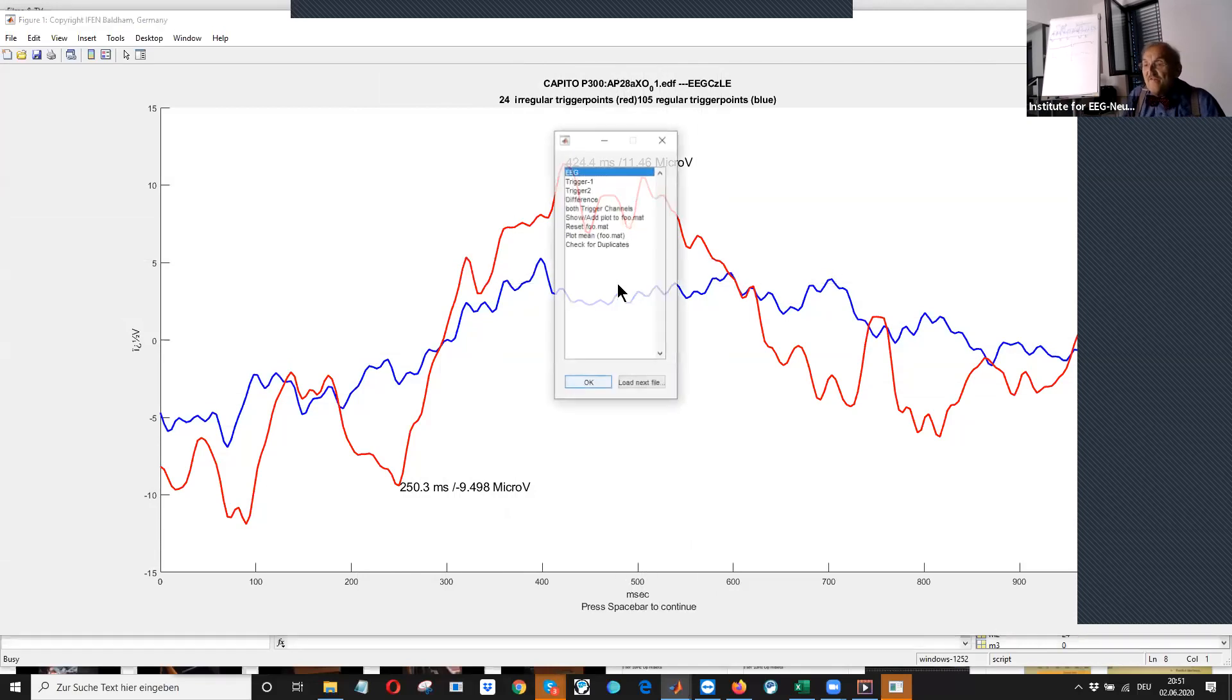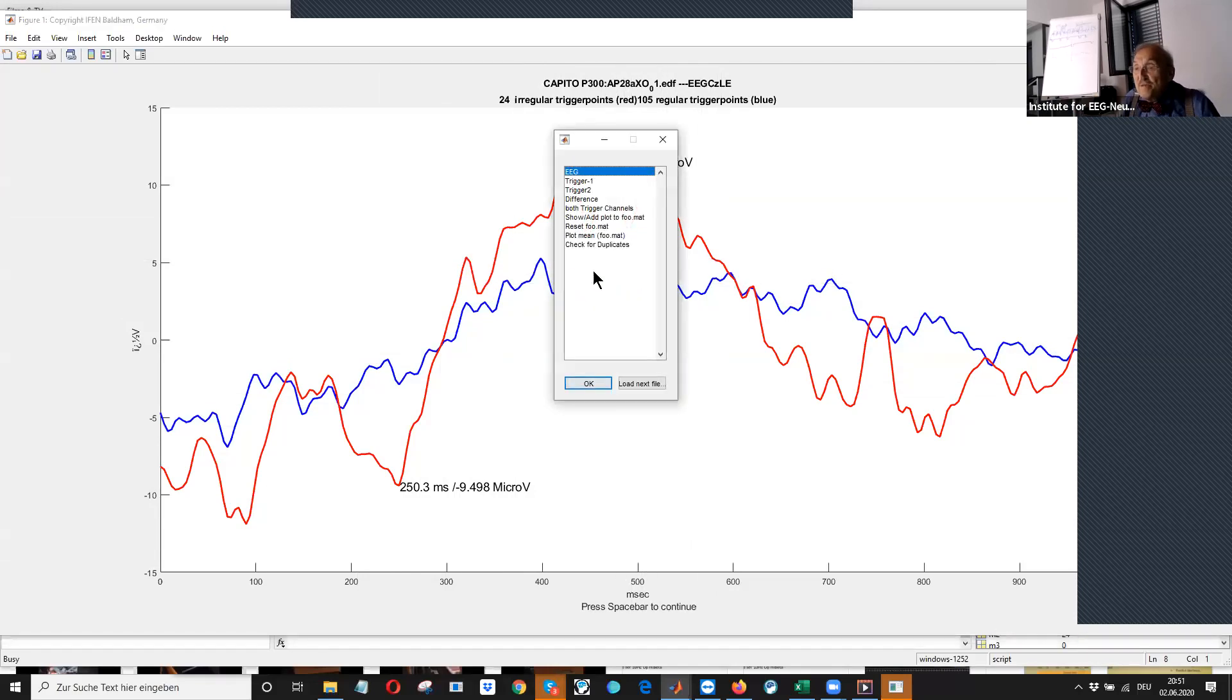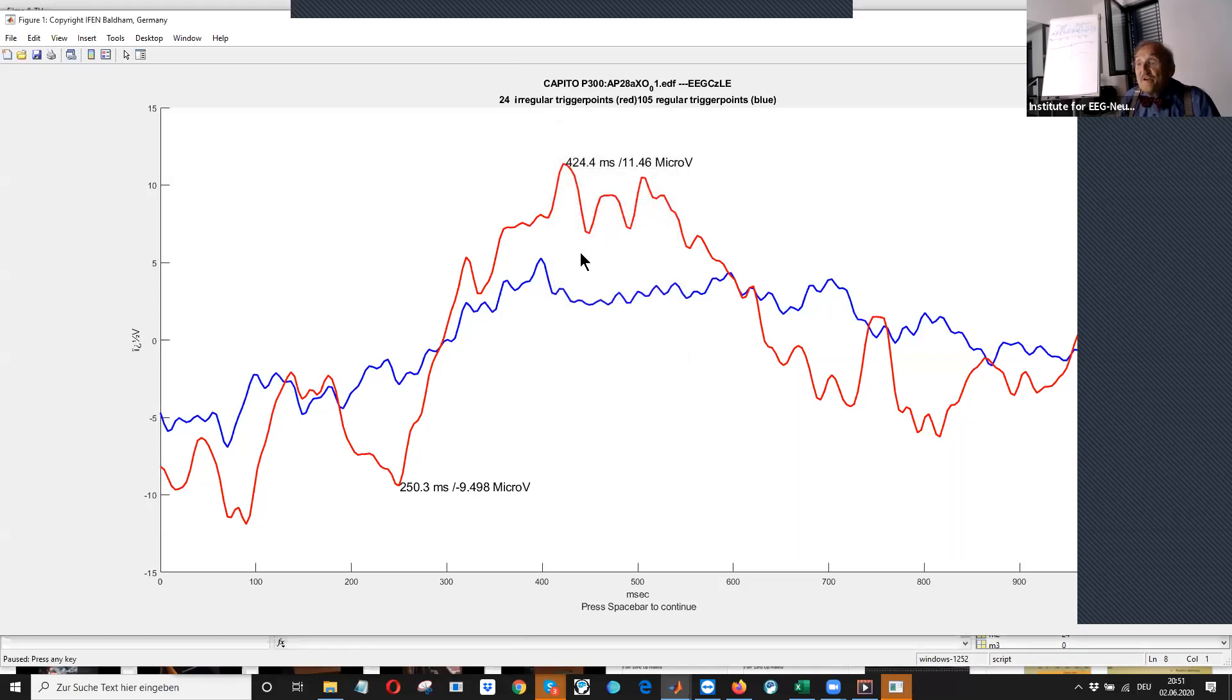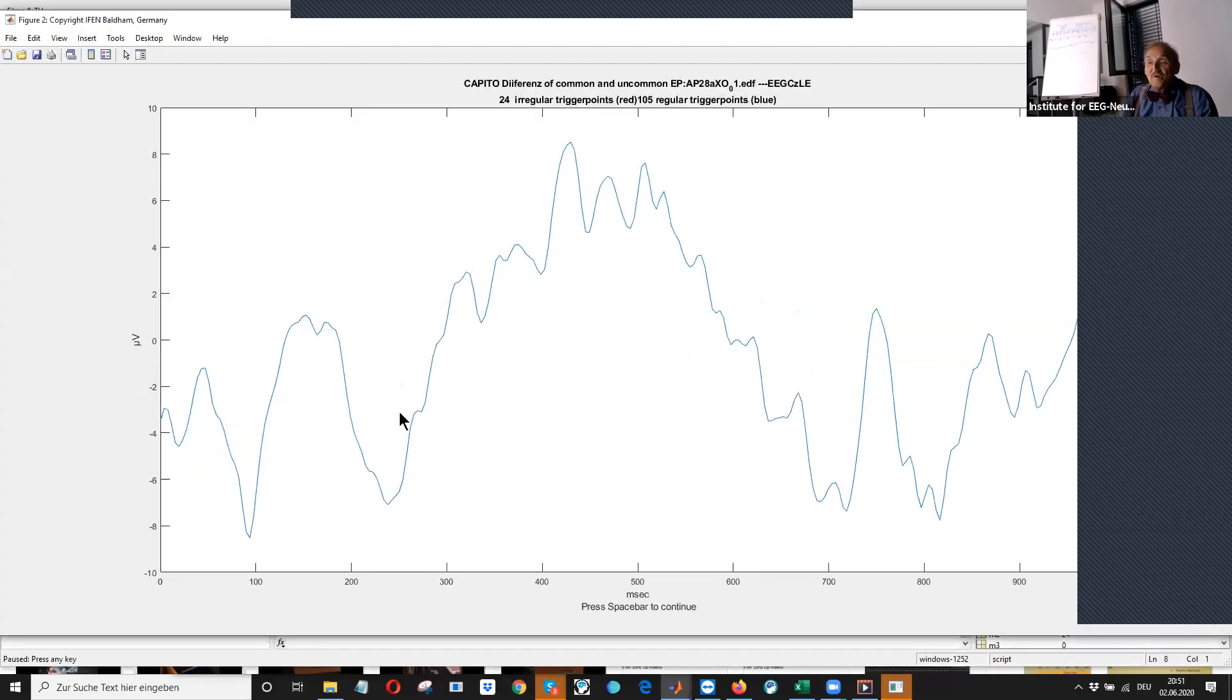For that I have programmed here some options. For instance, difference. This is the difference of common and uncommon trigger.